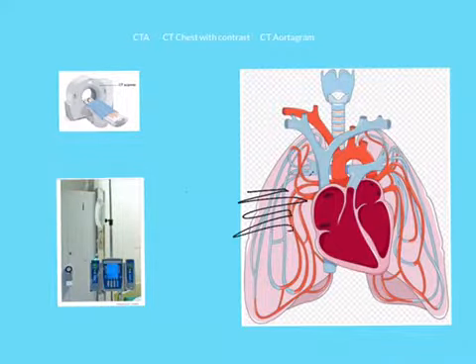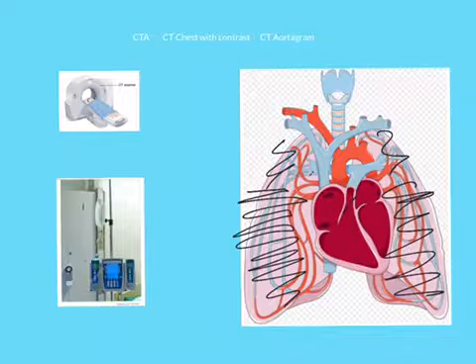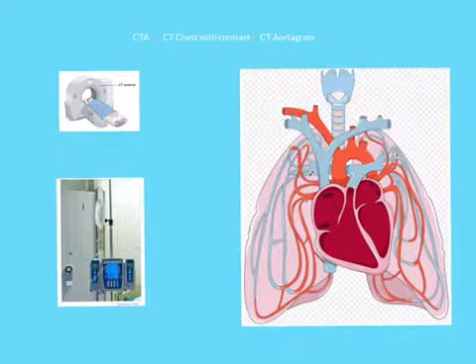All right, so let's say we're looking for a tumor, which means that we're looking for the area in here in the pulmonary tissue, in the pulmonary vasculature, basically the lungs. Again, please excuse the Morris High School marching band in the background. So let's say we're looking for a tumor in the lungs over here, or any place in the lungs.